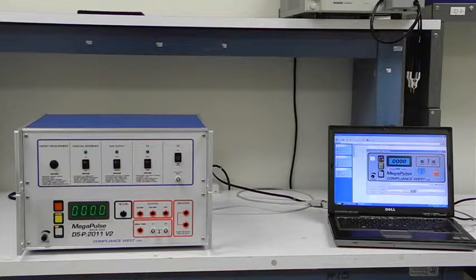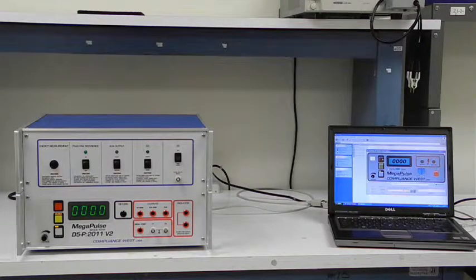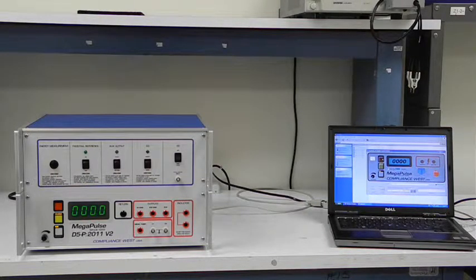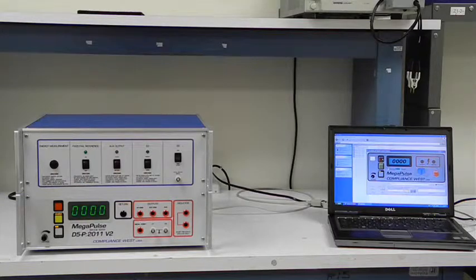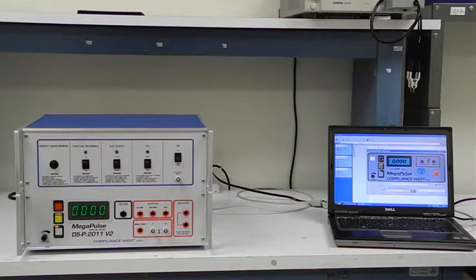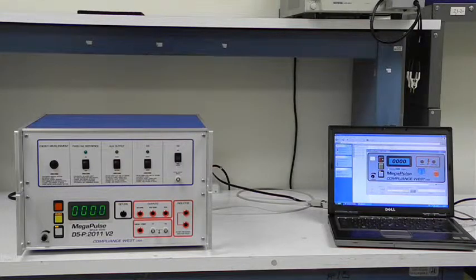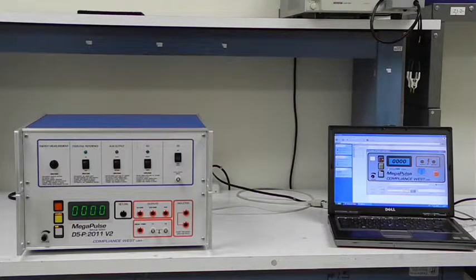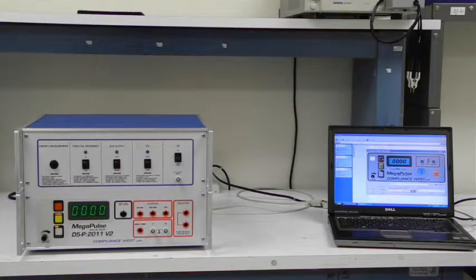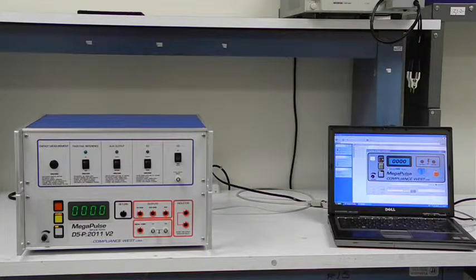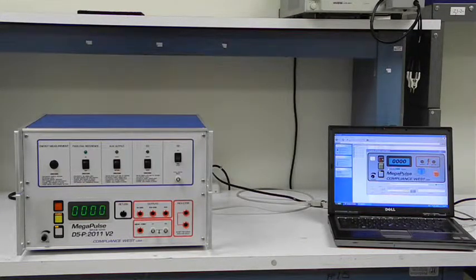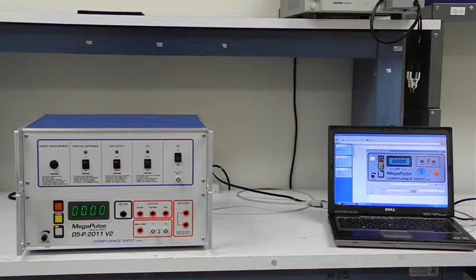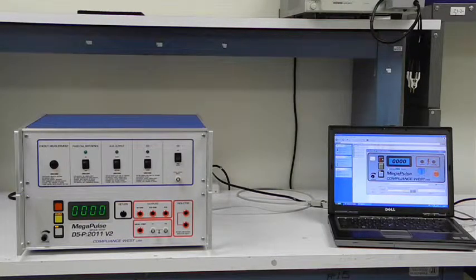In accordance with the requirements of IEC 60601-2-25 and 2-27, the Compliance West D5P 2011 V2 is designed to deliver up to 70 pulses and the 100 ohm resistor will maintain plus or minus 5% accuracy if the time between pulses is held to 30 seconds.